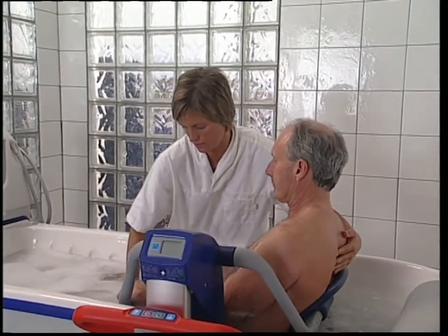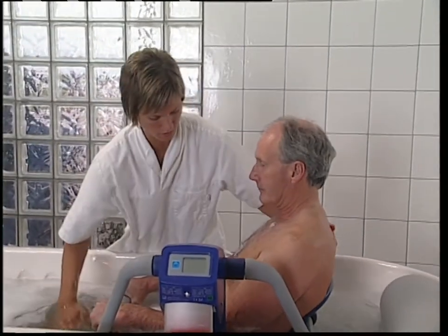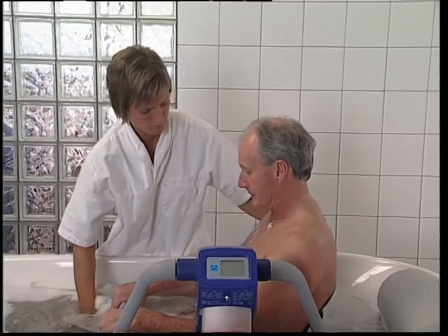Please refer to the operating and product care instructions for more information on how to use your Alente in the safest possible way.